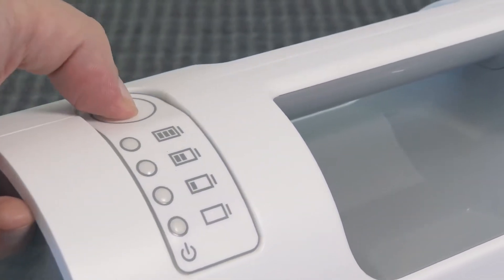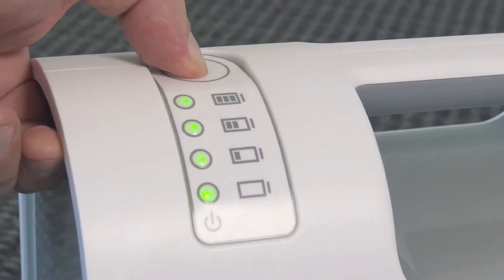Thanks to its portability, the Camel can be easily stored out of the way for emergencies. It takes about 16 hours to charge the compressor fully, which gives the unit at least eight full lifts, and the easy-to-read display means you'll always know how much power you have left.